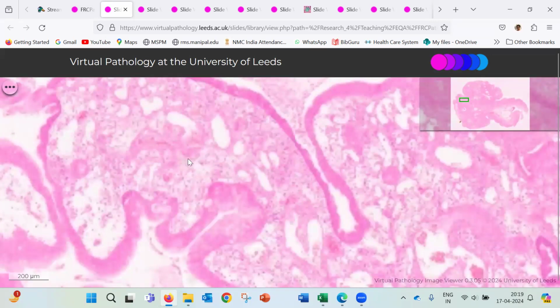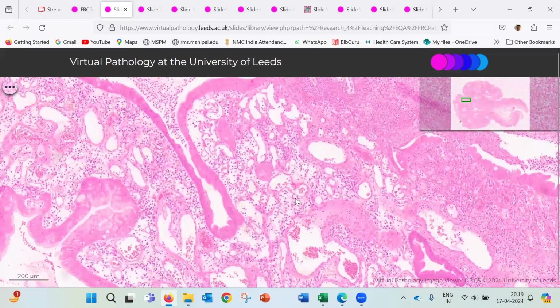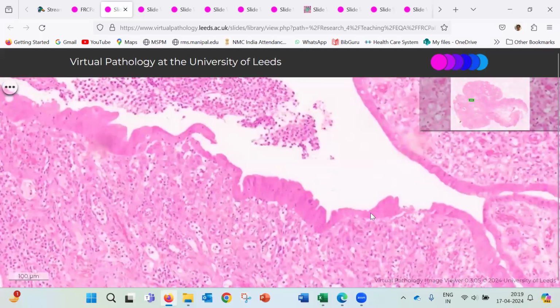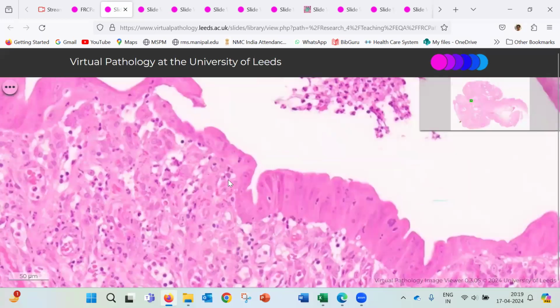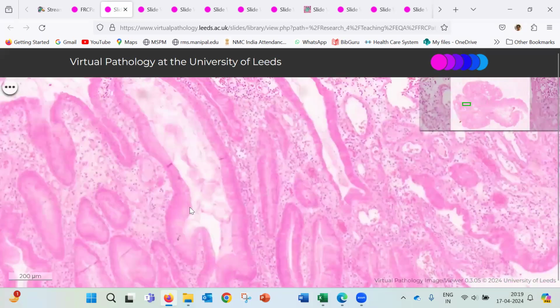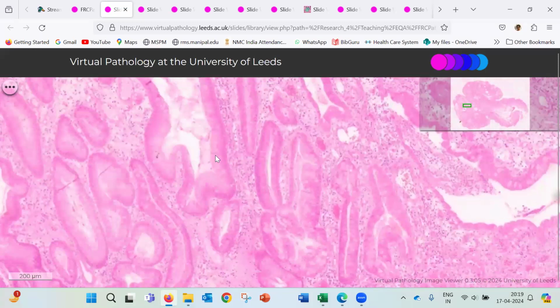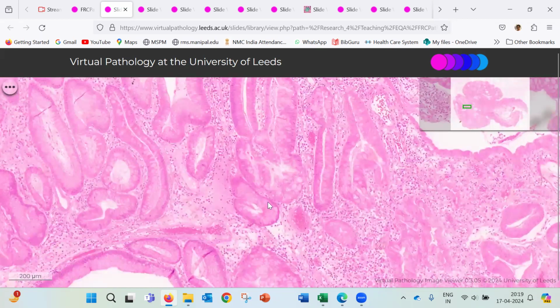there is quite an edematous lamina propria. We can see vascular prominence, vascular engorgement. The lamina propria is heavily inflamed. There is definite evidence of regeneration because of loss of mucin and some nuclear pseudostratification, because they are known to occur in any regenerative changes. And the normal gastric foveolar mucosa is there over here, and there are also areas of intestinal metaplasia.